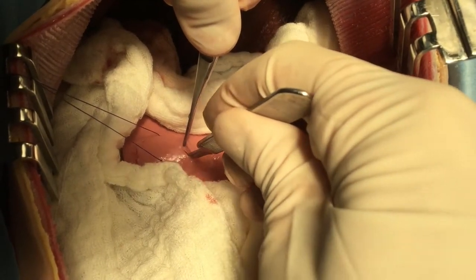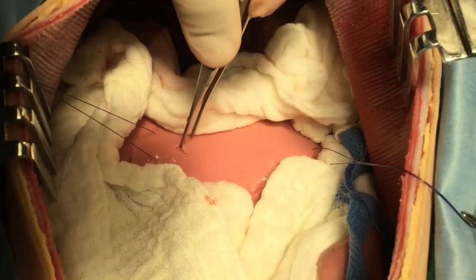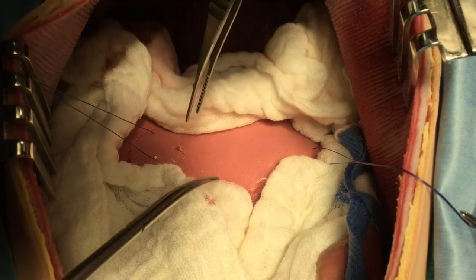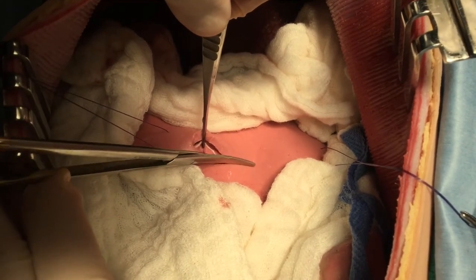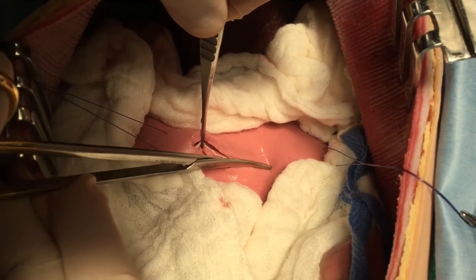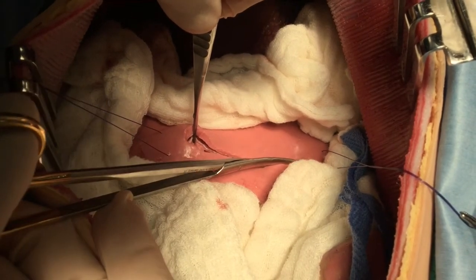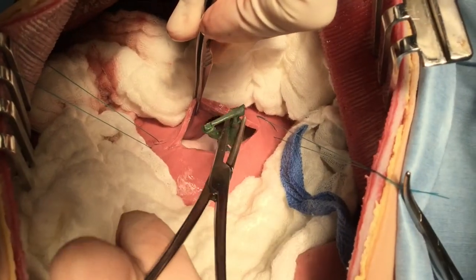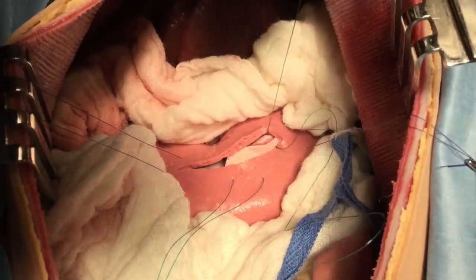A stab incision into the lumen is then made with a 15 scalpel blade. Be sure you penetrate both the seromuscular and mucosal sub-mucosal layers — they are quite distinct. This stab incision is extended carefully in a linear fashion with Metzenbaum scissors. Note the position of the gastrotomy: it is between the lesser and greater curvatures in the middle of the body.